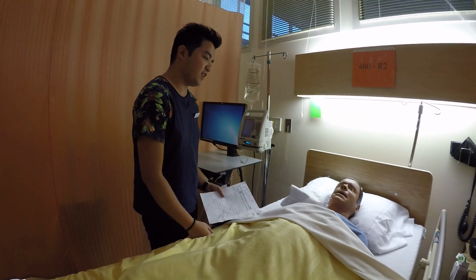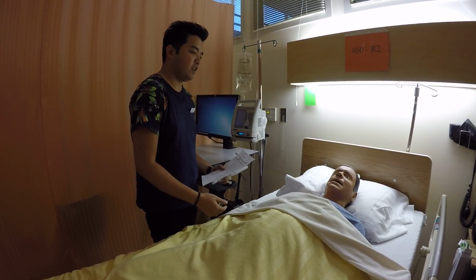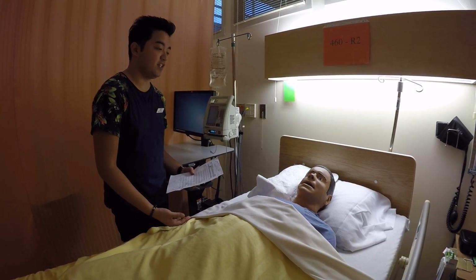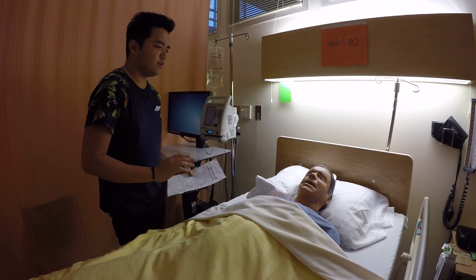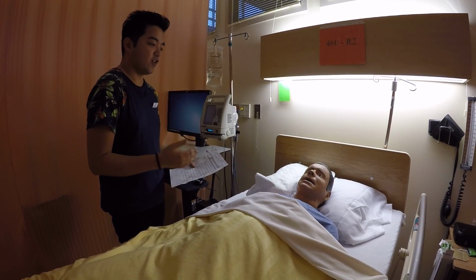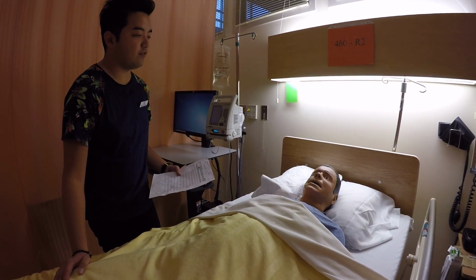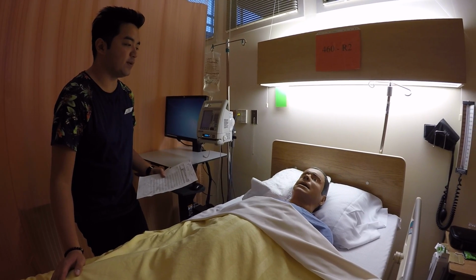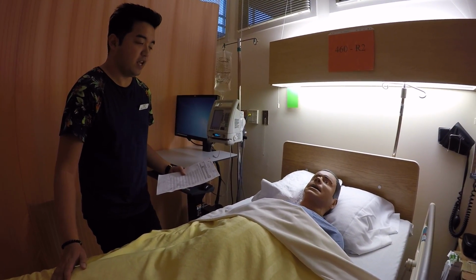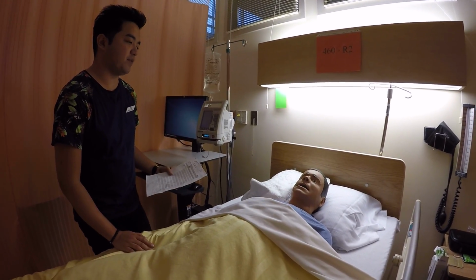So good day, Mrs. De La Cruz. My name is Ancy, and I'm going to be your student nurse today. So I'm going to be giving you a medication. It's called cefoxitin. Cefoxitin is for the treatment of your pneumonia. So usually this has some common side effects such as nausea, vomiting, and dizziness. And then sometimes it causes swelling of the legs and the feet. So if by any chance you experience some of these symptoms, just call us, and I'll also check on you from time to time, okay?